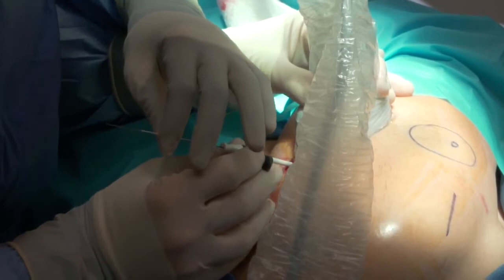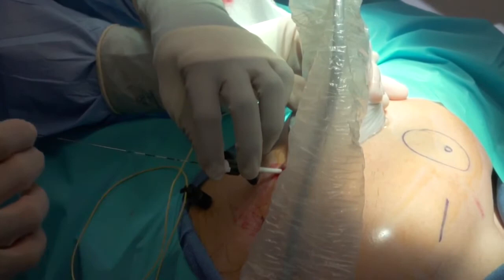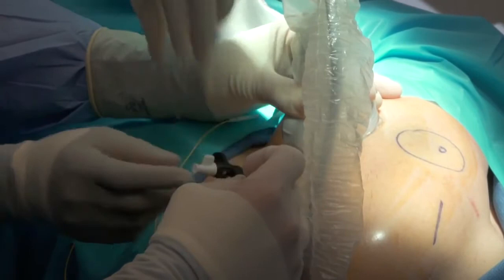So what I'm going to do now is remove the stim probe. Okay, hold that, my friend. And then, Michael, what I'm going to need you to do is turn the probe here. Okay, you see this thing right here? Not the full probe, like the screw part. Yep, right there, my man. And then we're going to pull that out. Good.